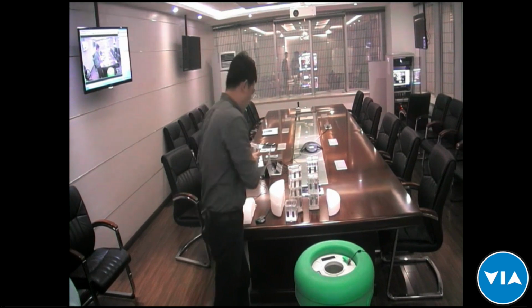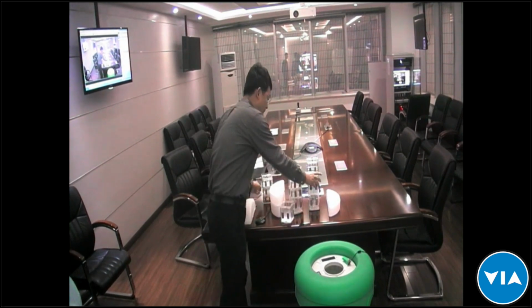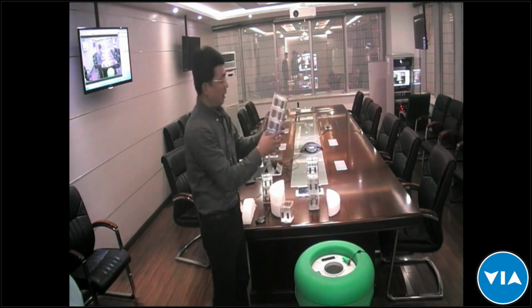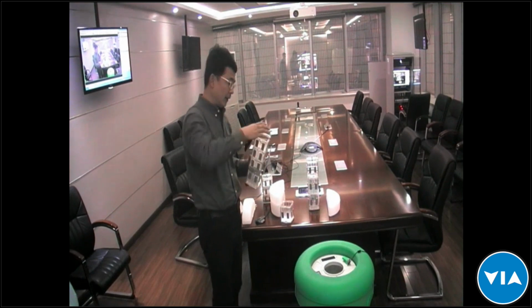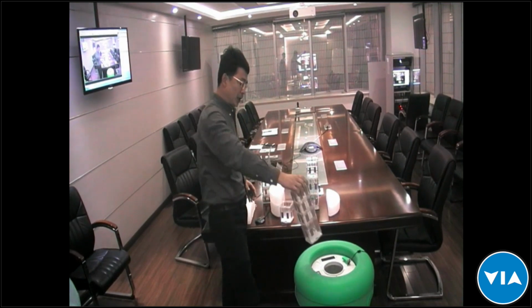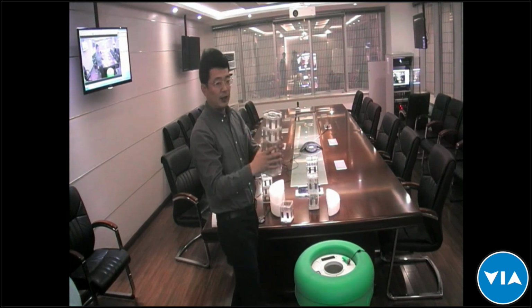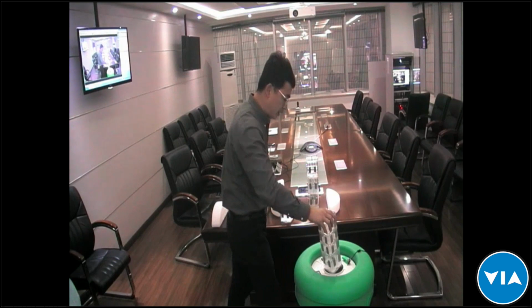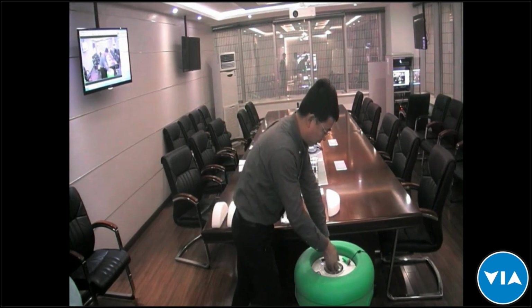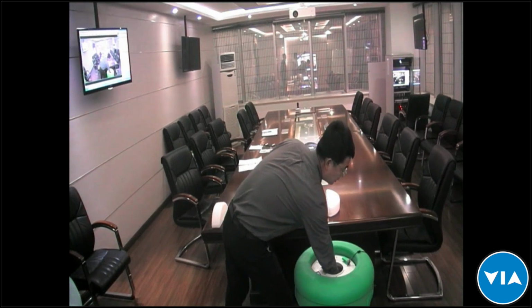After the vial is placed into the vaccine deck, we need to place the vaccine deck into the Arktek device. First is the side one. We place the side one into the device and push it against the inside wall.